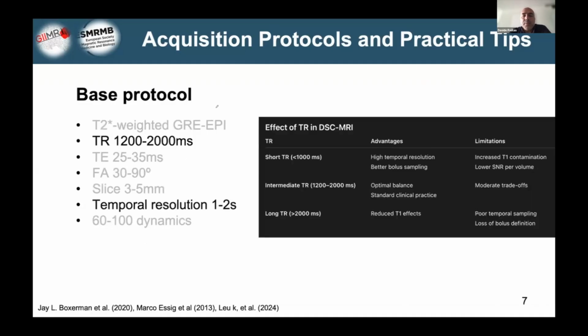Repetition time is a key parameter in this acquisition, as it directly determines the temporal resolution. In practice, we aim for a TR between approximately 1200 and 2000 milliseconds, which results in a temporal resolution of about 1 to 2 seconds per volume.